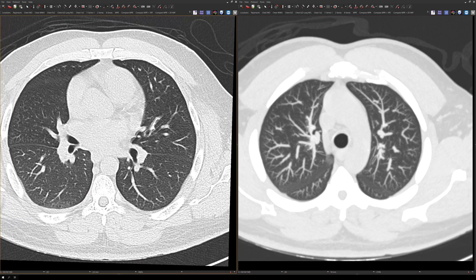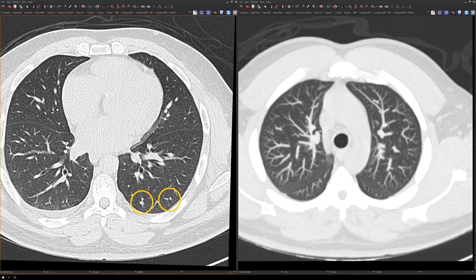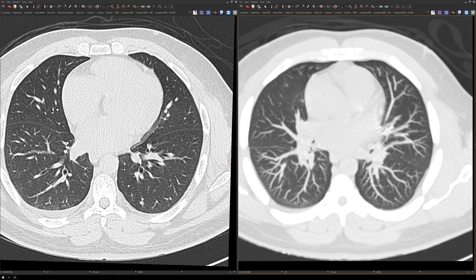If you were looking closely, you probably saw these two nodules right here. But they were much easier to see on the MIP images, and here's why. On the MIP images, you can see that vessels are displayed as long branching structures, as opposed to the nodules which look like nodules. On the lung recons, with just a static image, it can be difficult to tell the difference between a vessel and a nodule — for example, is this a vessel right here or is it a nodule? Looking at the MIP images, we can see that that's actually a vessel.